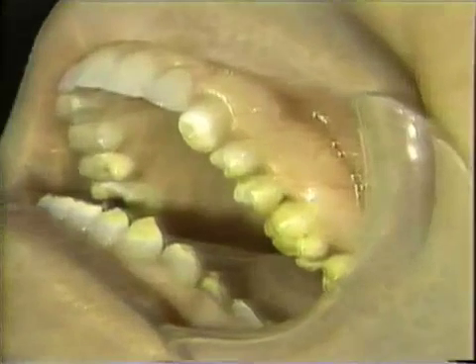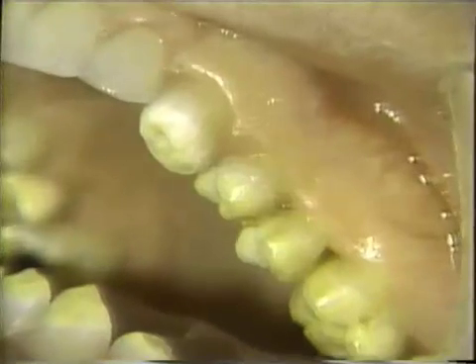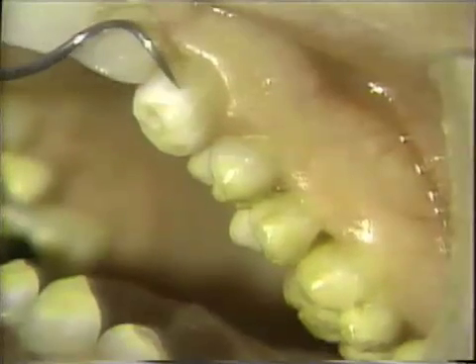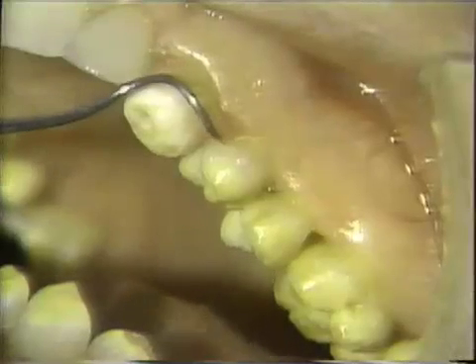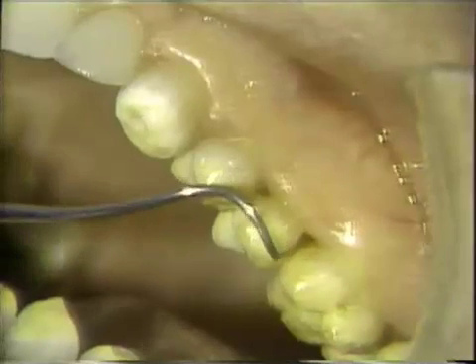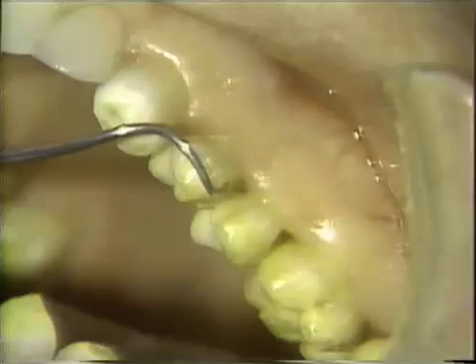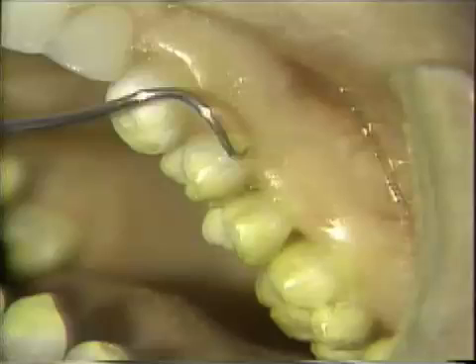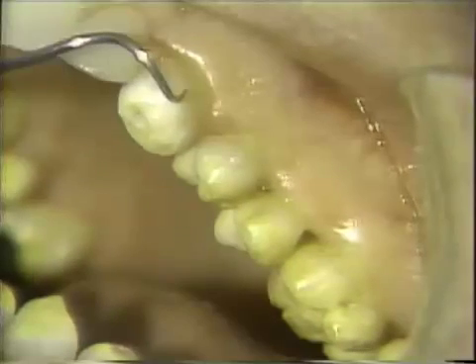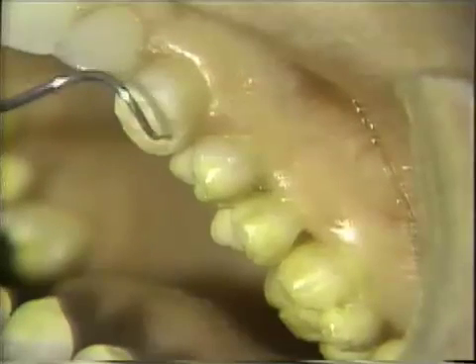We are going to prepare the two bicuspids and the cuspid for porcelain laminates. The teeth have been stained or discolored by tetracycline, and it's important for us to mask that purple staining on the cervical. The preparation will have to be a little bit deeper in this area than non-stained teeth.